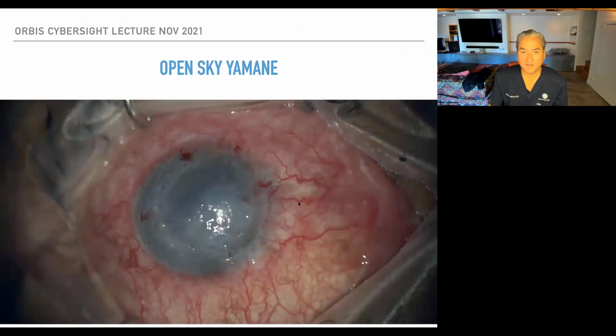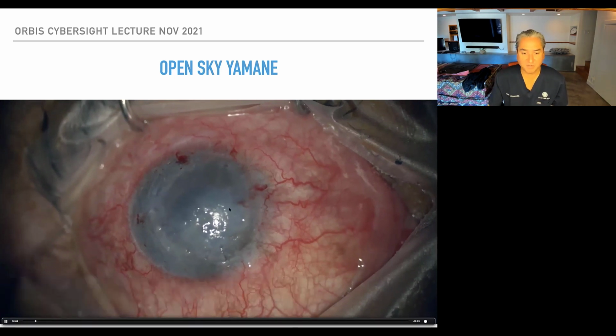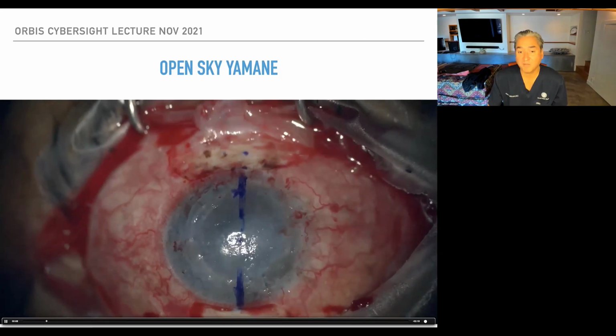We're at 8:45. Okay, here's a case that I just did earlier this year. This is a situation in which they have a failed graft that's cloudy, and they're aphakic because of trauma. There it is. I narrated it. You can find this on my YouTube page. But basically, this is one of those cases where they're aphakic. So I could suture one in, but I'm going to do the Yamane.